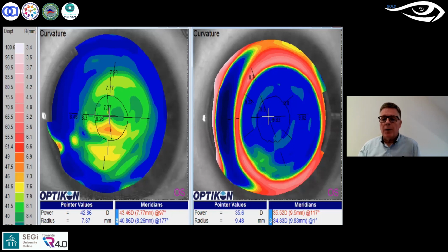And finally, this was a colleague of mine. This was an optometrist. I was fascinated by this particular ocular condition. He had an irregular cornea on his left eye. This is his left eye topography without a contact lens. And we can see, again, this subclinical level of keratoconus. This is keratoconus at a very, very low level.